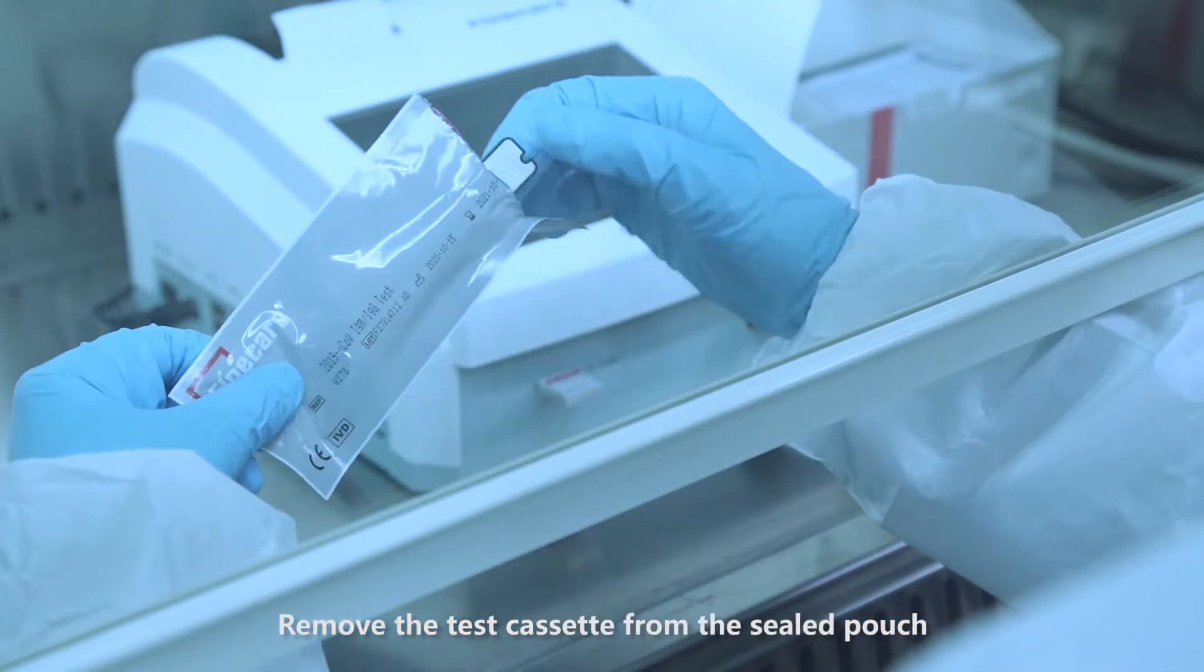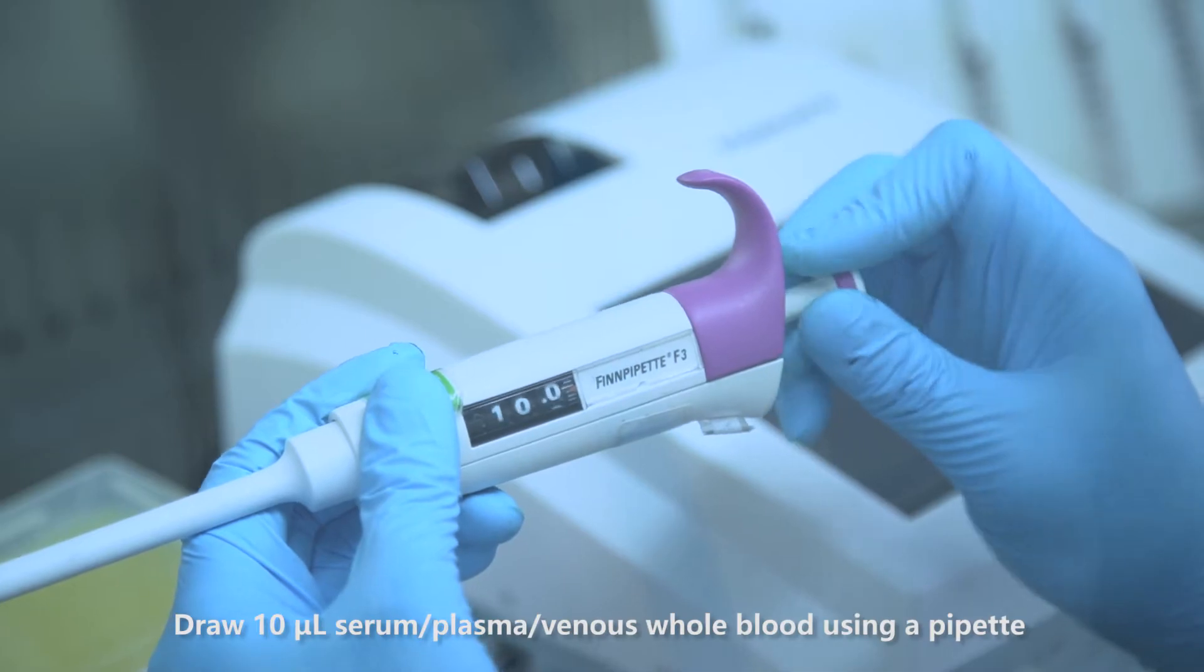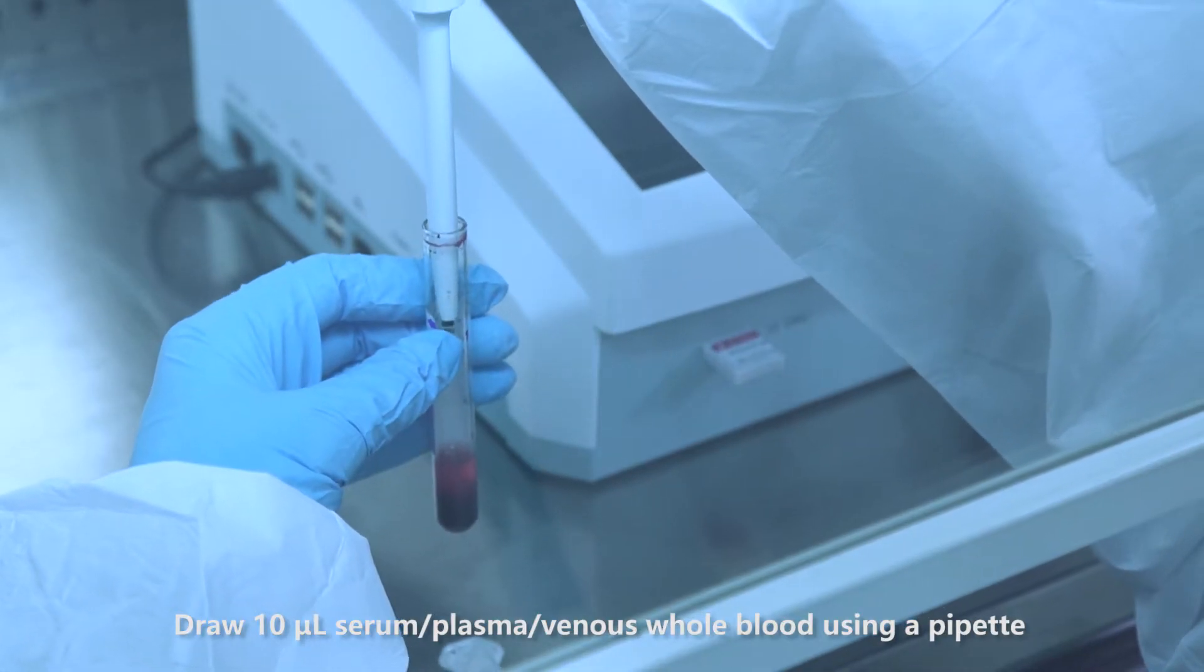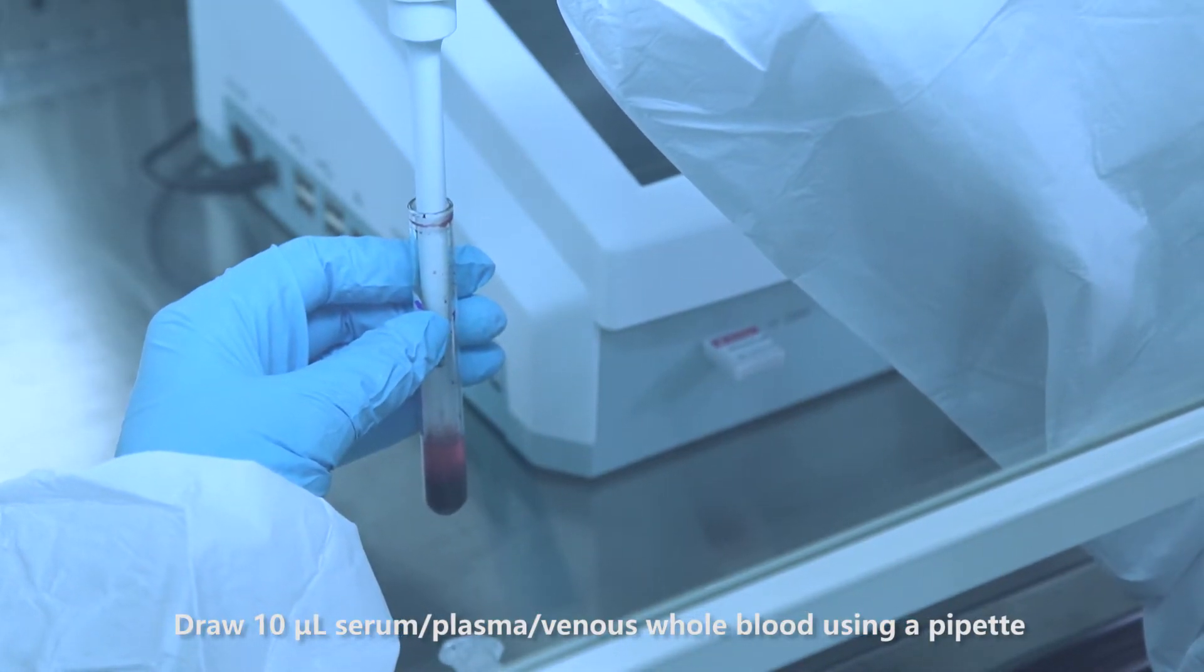Remove the test cassette from the seal pouch. Draw 10 microliters of serum, plasma, or venous whole blood using a pipette.